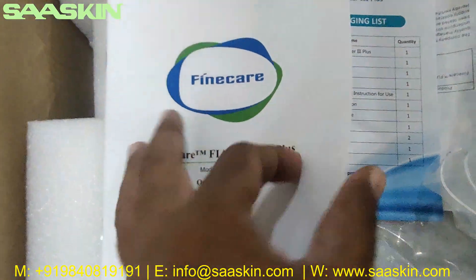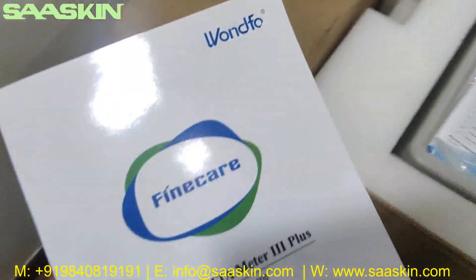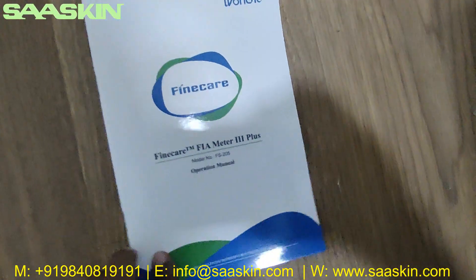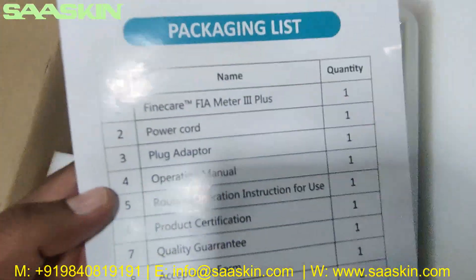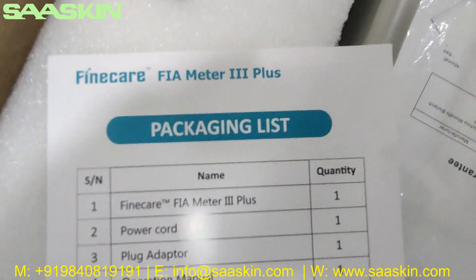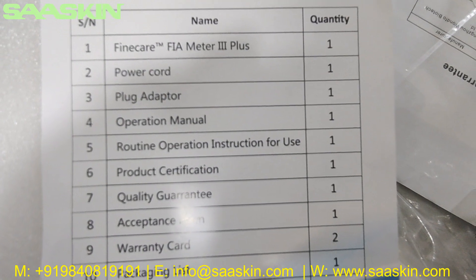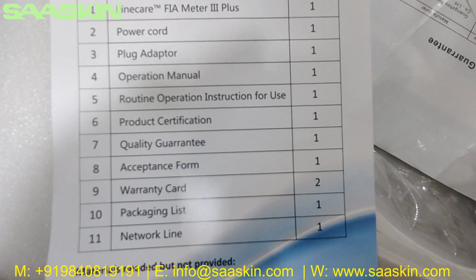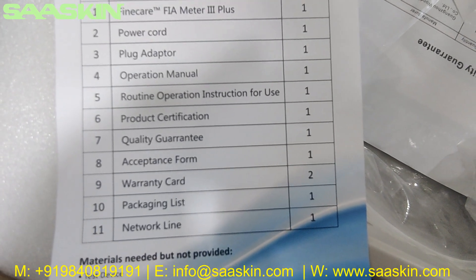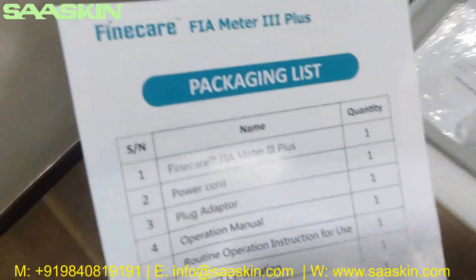You can see there is a complete operation manual. I'm just keeping it aside. You also have a packing list of the contents. It says the Fine Care FIA Meter 3 Plus comes with a power cord, plug adapter, operation manual, routine operation instruction for use, product certification, quality certificate, guarantee certificate, acceptance form, warranty card, packaging list, and network line.